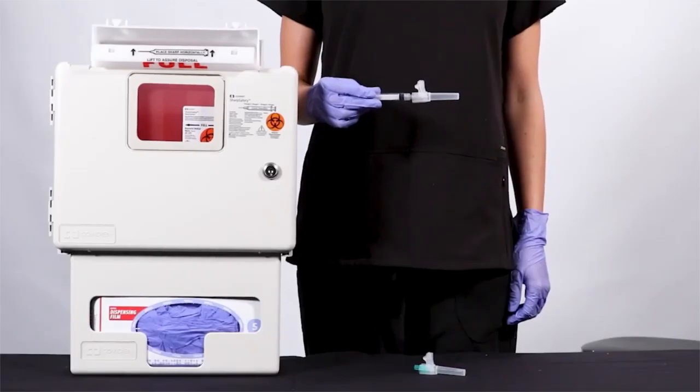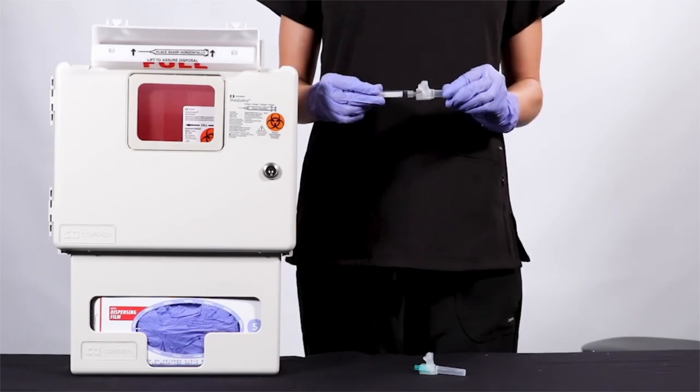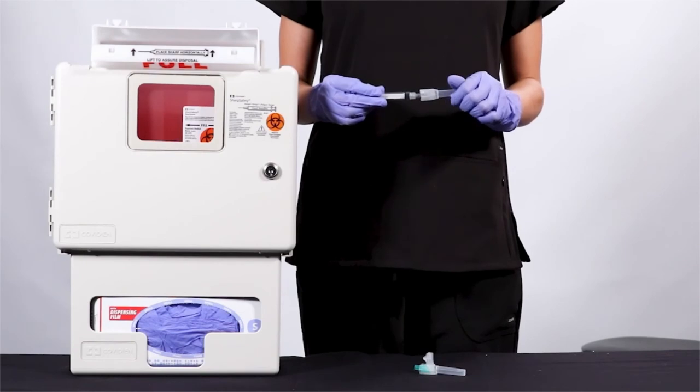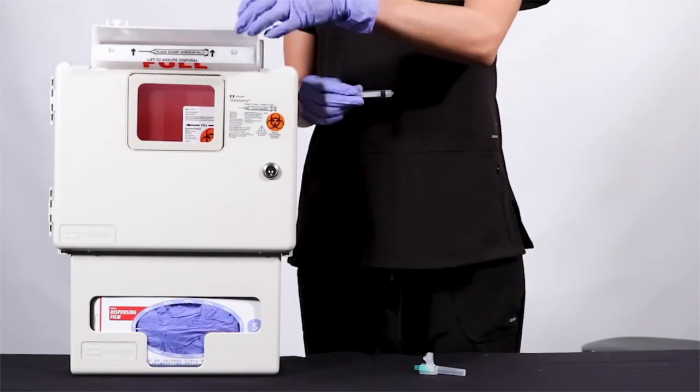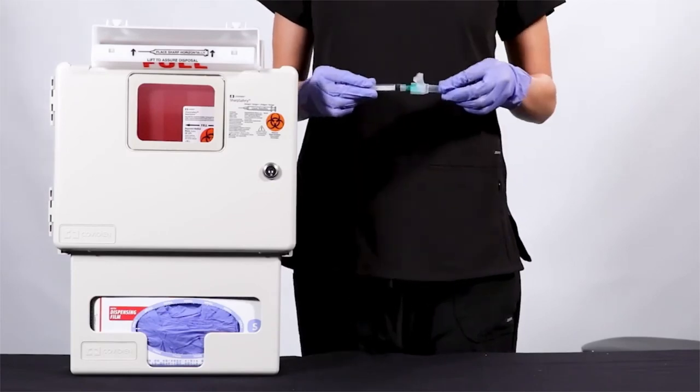If your application requires the use of multiple needles, simply disconnect the activated needle. The color hub offers a flat, easy-to-grip surface that indicates where to place your fingers. Immediately dispose of the activated needle in an approved sharps disposal container and attach a new safety needle.